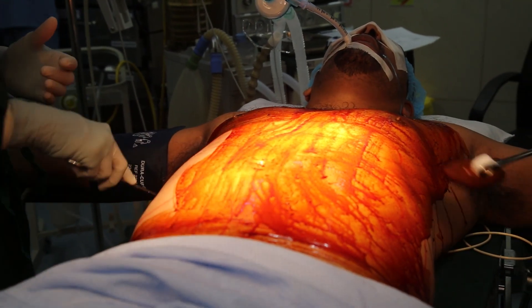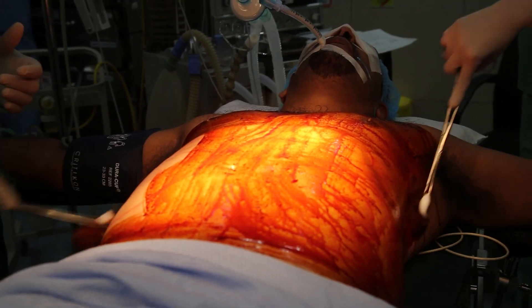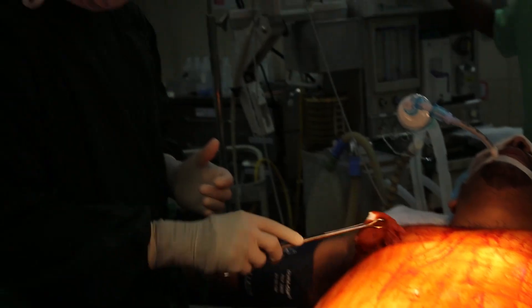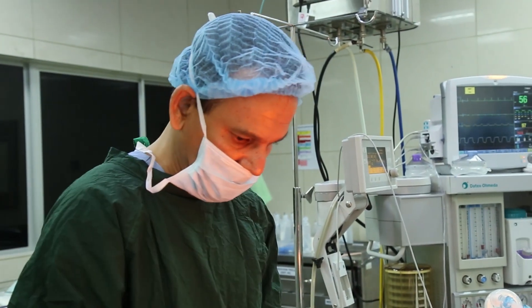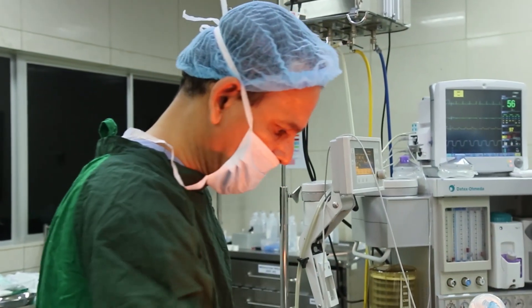Preoperatively, we mark the areas as circles. The prominent areas that need to be tackled are drawn as circles and squares. Measured amounts of fat are then sucked out.